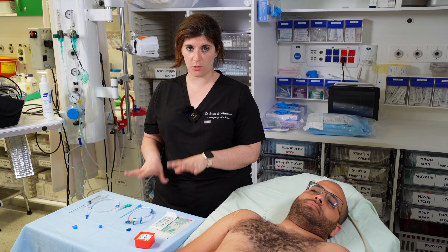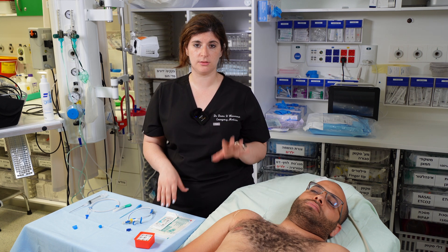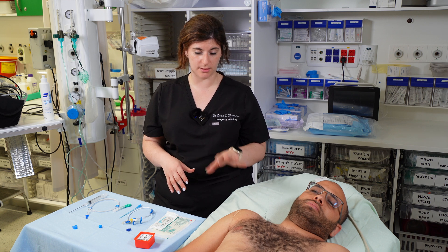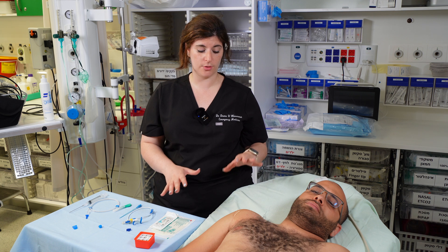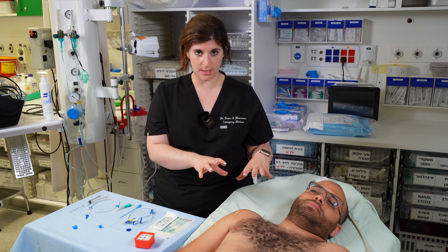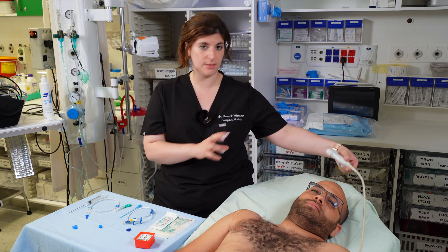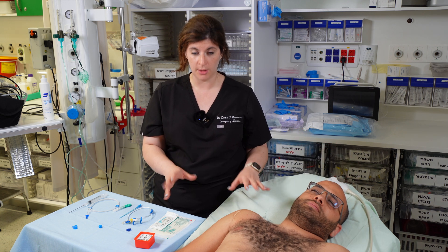Once all your equipment is set up, clean the patient using at least three chlorhexidine or iodine wipes, then drape the patient. Make sure the drape leaves enough space to find your anatomy again with the ultrasound. You're also going to put a sterile cover on the ultrasound probe.